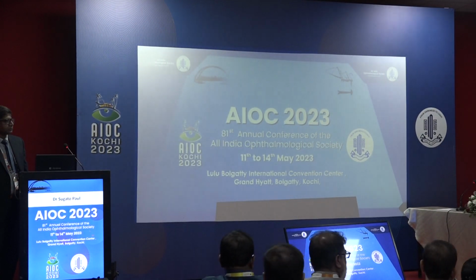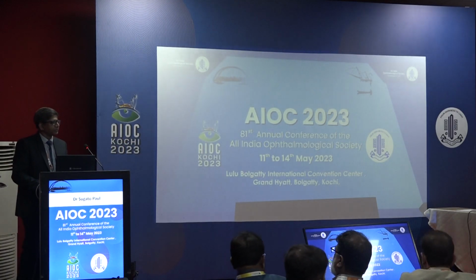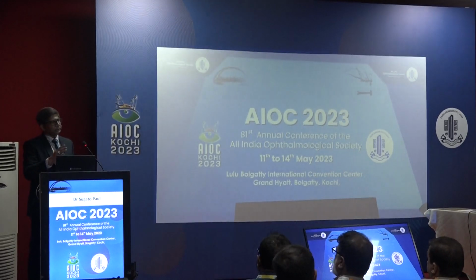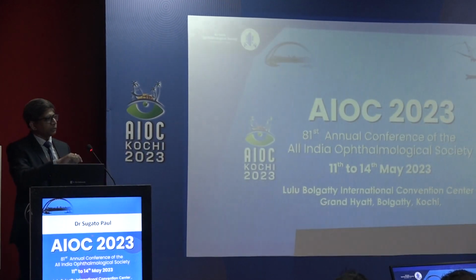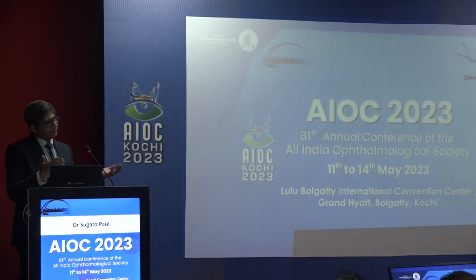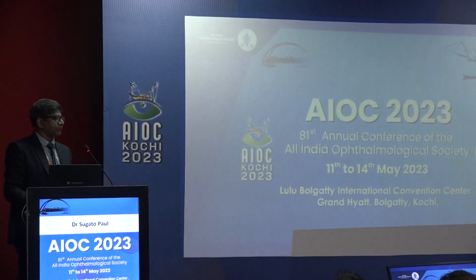With your excellent skill, you passed your 10 minutes with all the apprehensions and with your strategies. But what message are you giving to common average skilled surgeons? I am an average skilled surgeon, sir. If we follow the techniques, like not doing the phaco where it's extended, not rotating the nucleus hard where the zonule is pressed, with the 2 tips I'm rotating, so no pressure is on the zonule. And then you have the scope of bringing the nucleus up into the anterior chamber. And the third thing, you have to get rid of the ego if required and convert to SICS.